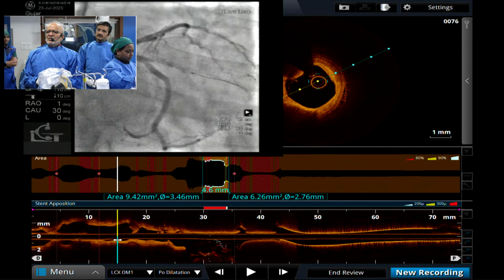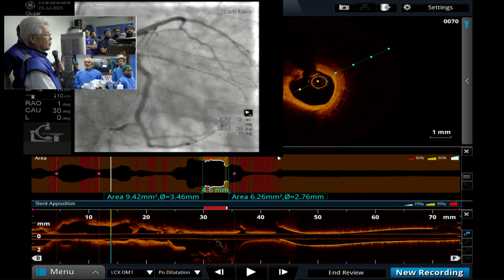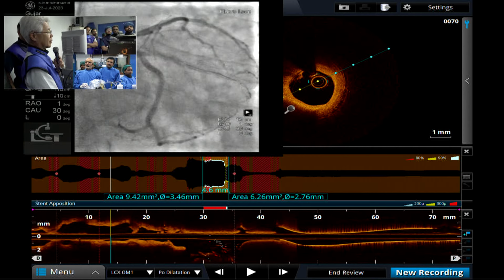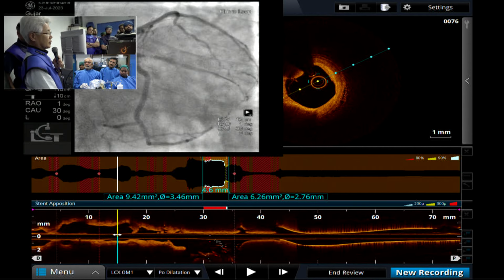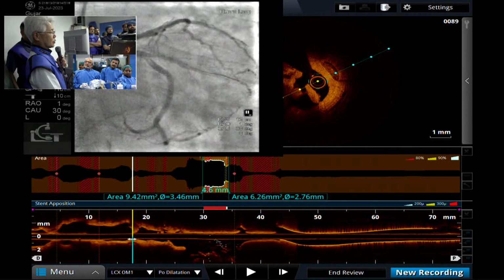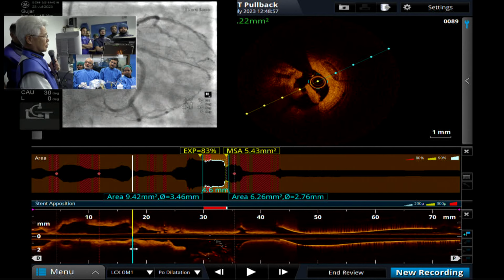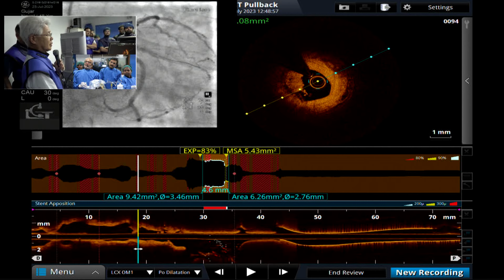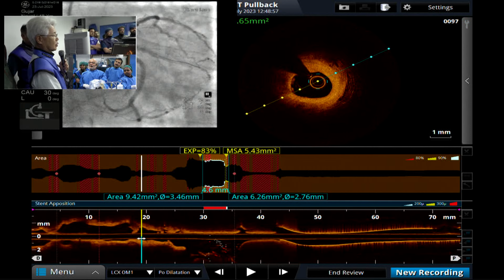Here is the distal OM, right? Yes, there are lots of basically fibrous and fibrolipidic plaque. Fatty. And then move to the proximal site. Some dissection here by ballooning. And also here this might be an organized thrombus. White thrombus? Basically white thrombus, yeah. No shadow, right?